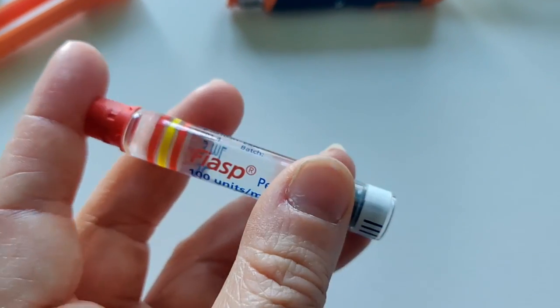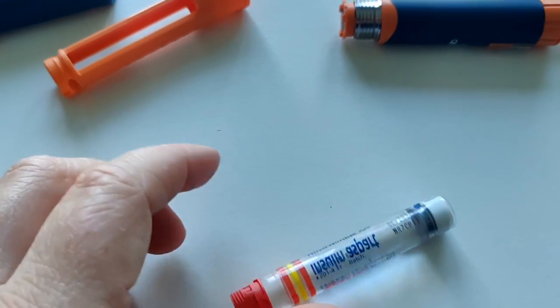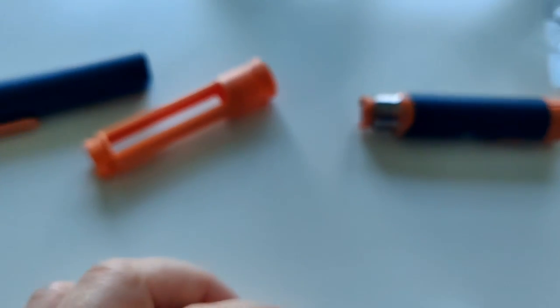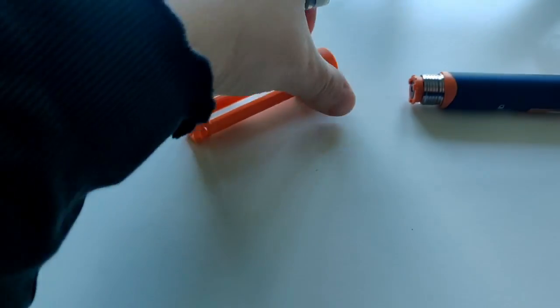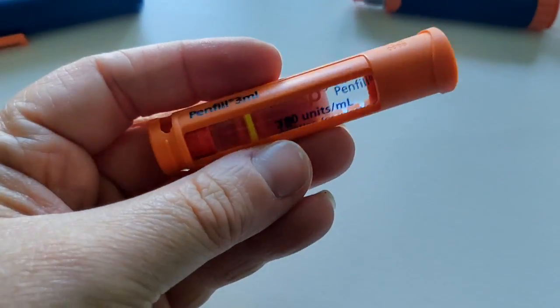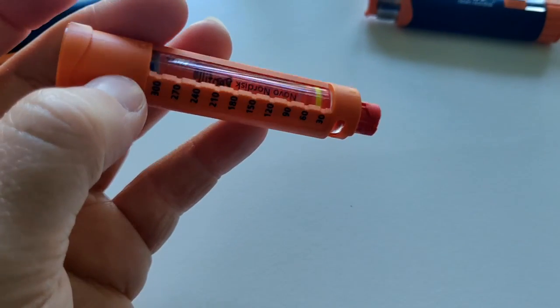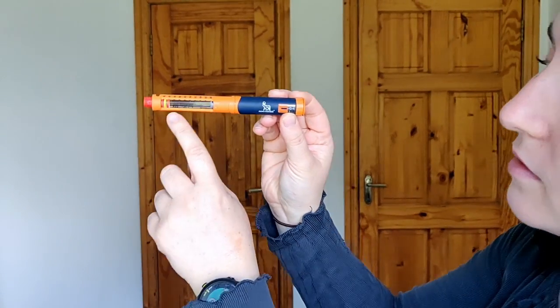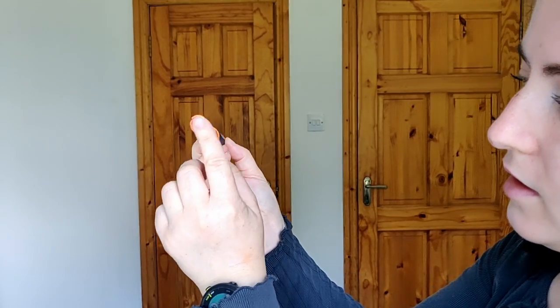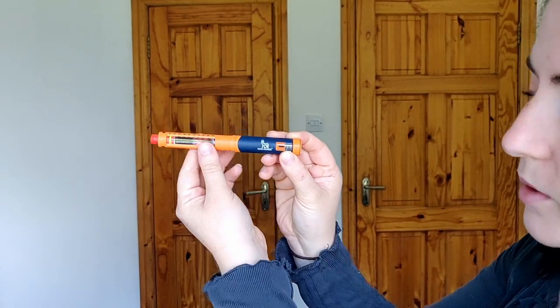Today I have a vial of Fiasp, so I'm going to put it in here to demonstrate. This Novo pen wouldn't have had Fiasp in it before because Fiasp wasn't invented at this point, but it does fit in nicely. This is how it would look with the vial in. The needle would be attached on here, and this is where you dial up.